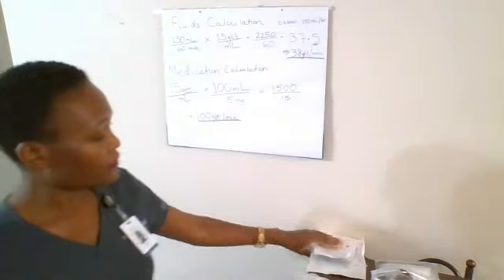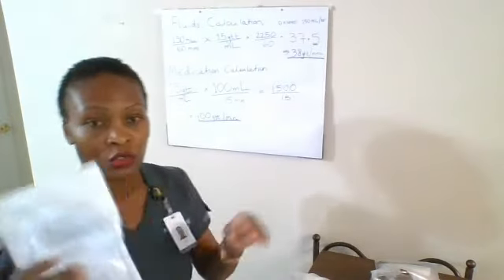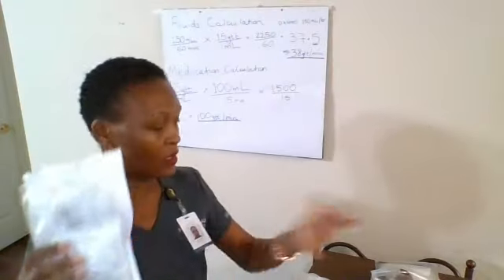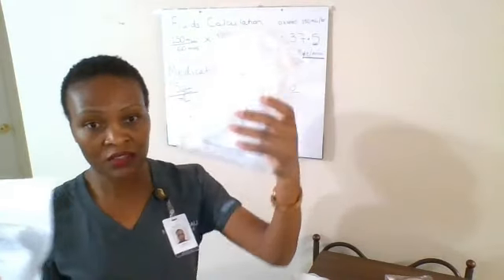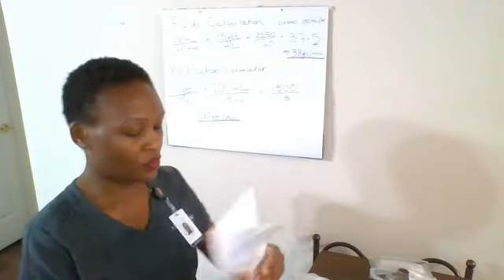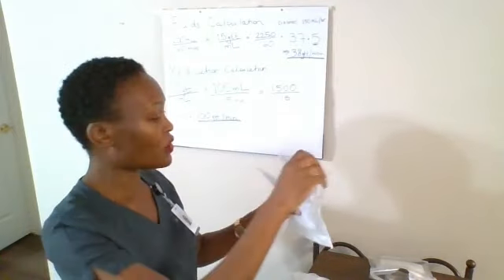I'm going to have 2 primary tubings with me here. I have 1 primary and I have 1 secondary tubing. So I have 2 tubings with me. I'll start with the primary tubing. The primary tubing is what I'm going to use for my IV fluid.